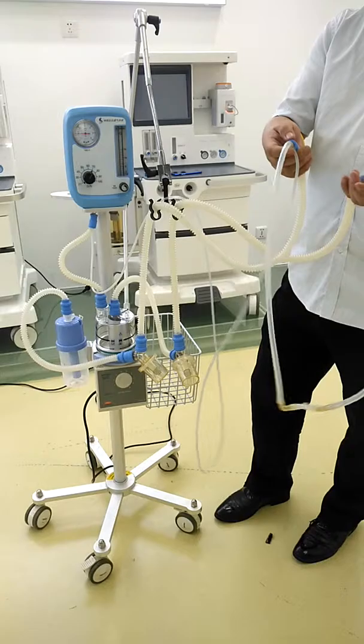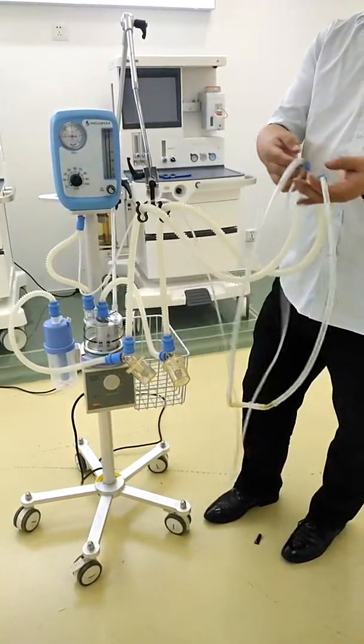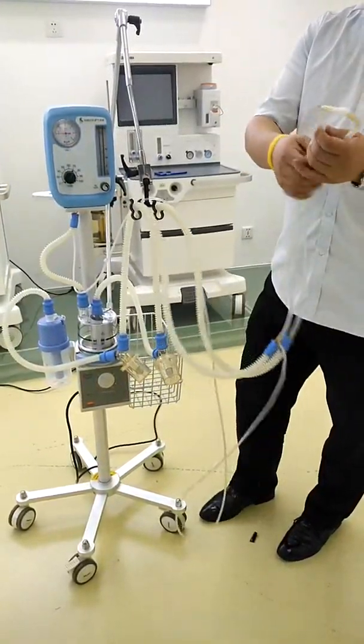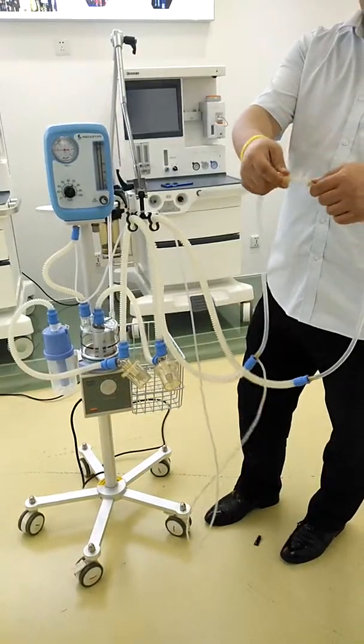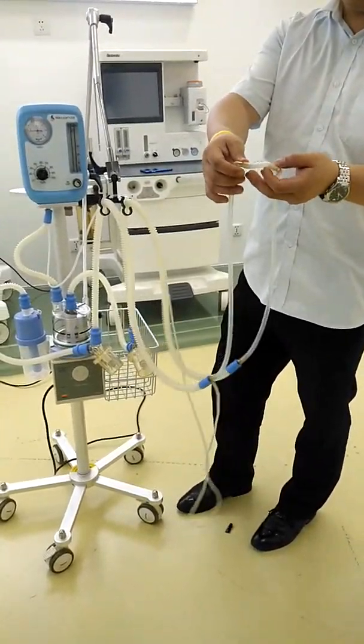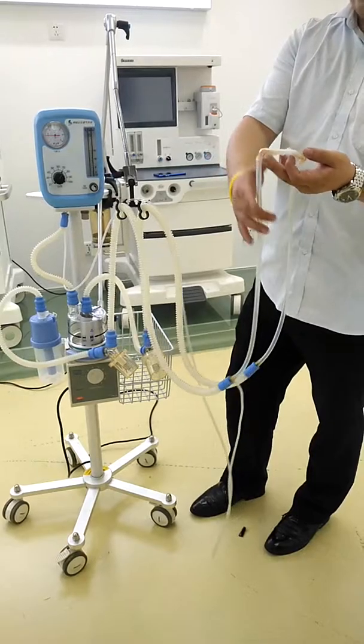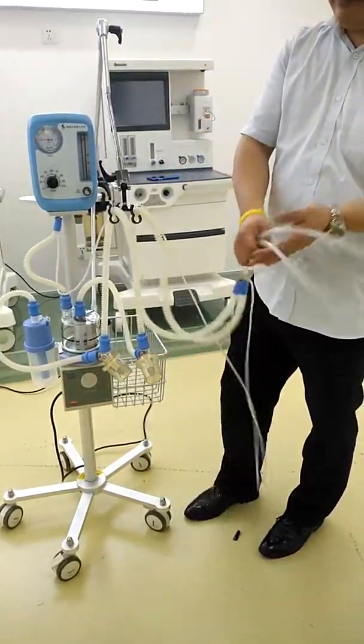Here we're using a nasal prong to connect with two long pipelines. On the front here is the nasal prong, which we can place on the baby's nose with a head cap to make it very tight for the baby to breathe more comfortably.